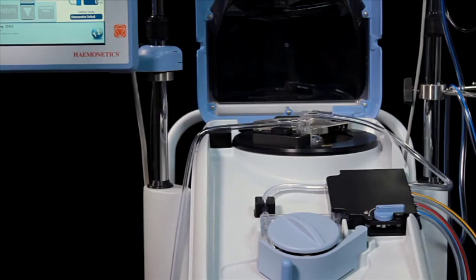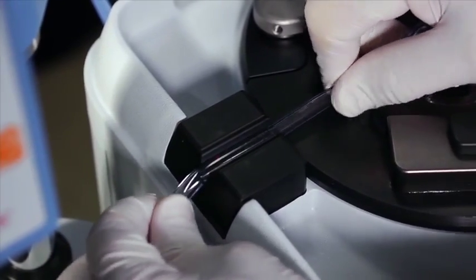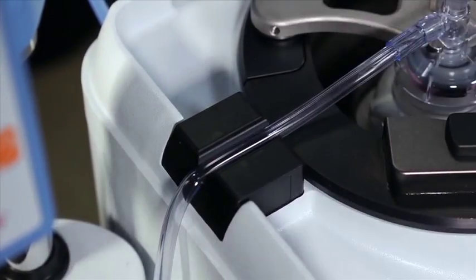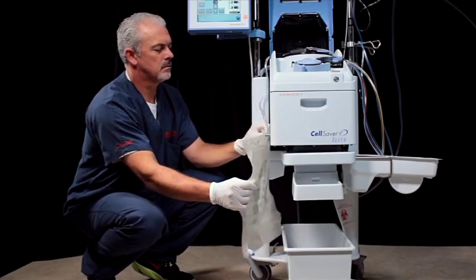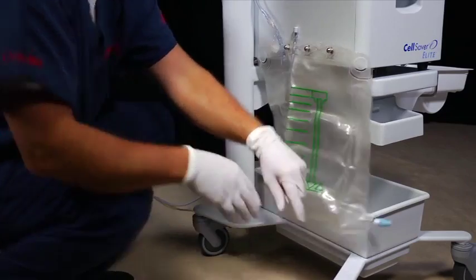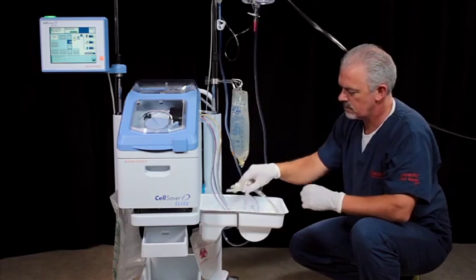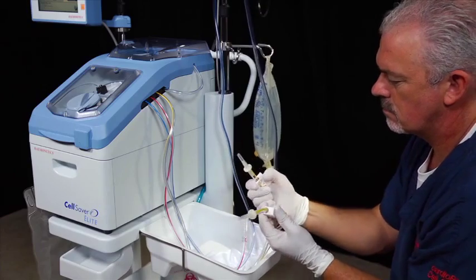Next, floss the effluent line tubing into the effluent line sensor. Ensure it is touching the bottom of the sensor. Then, hang the waste bag on the waste bag weigher and check to ensure the drain port is securely closed. Close the device cover. Close clamps on the yellow line tubing.